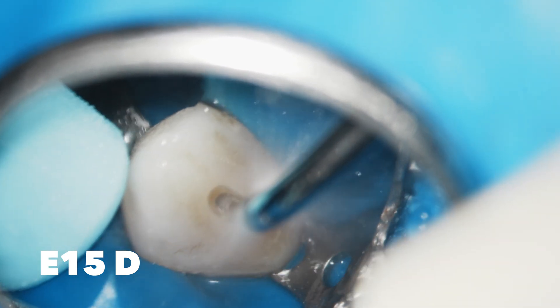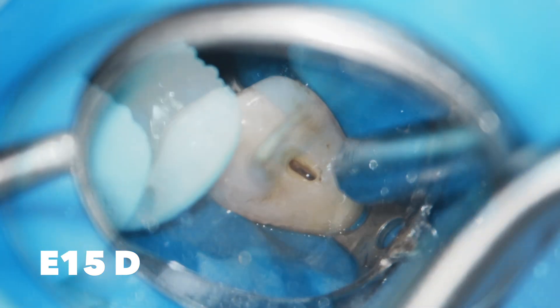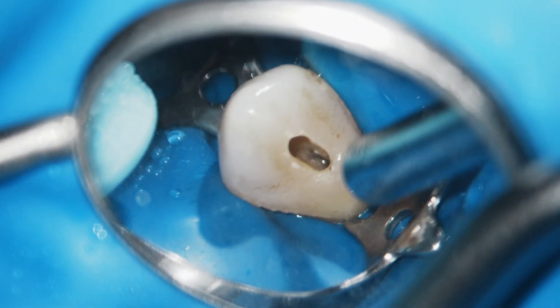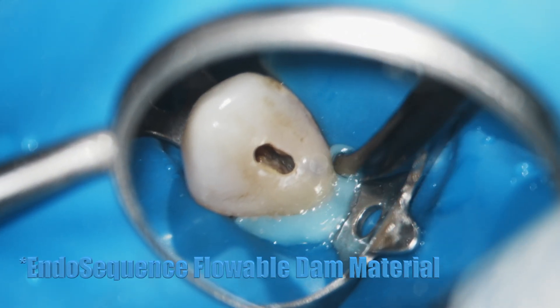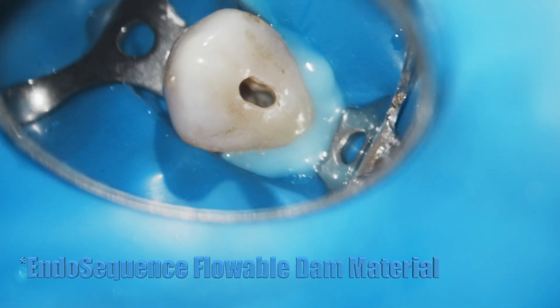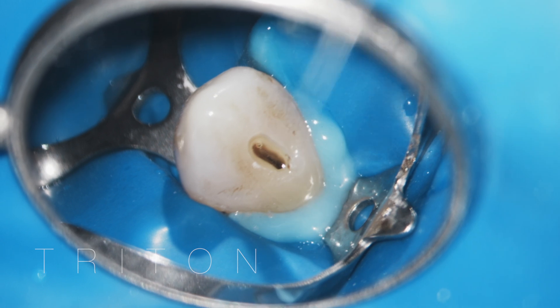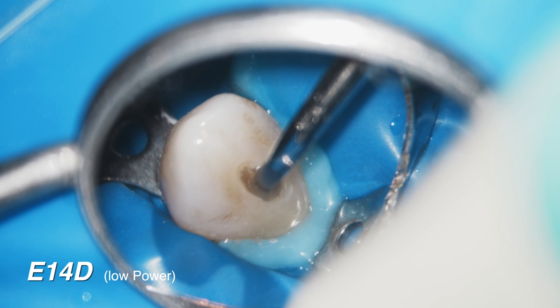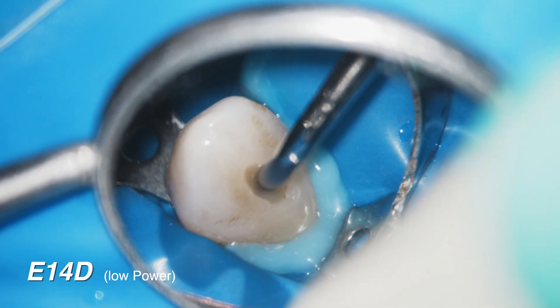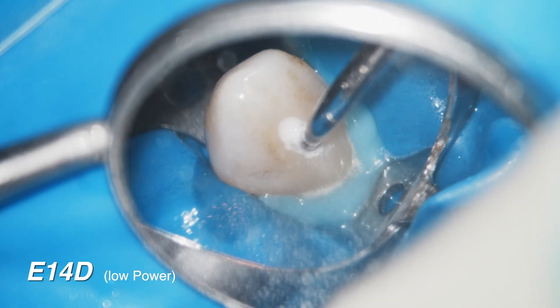After isolation and initial access, I'm using my E15 ultrasonic tip to break down this large calcification in the middle of the tooth. We can see that the inside of the tooth is kind of empty — that's due to the fact that it's gone necrotic. At this point we want secondary isolation with my EndoSequence flowable dam material, nicely sealed, so I can proceed to place Triton inside the tooth. This contains both disinfection and chelation going on simultaneously. I then place the Triton and use my E14D without water to activate it.